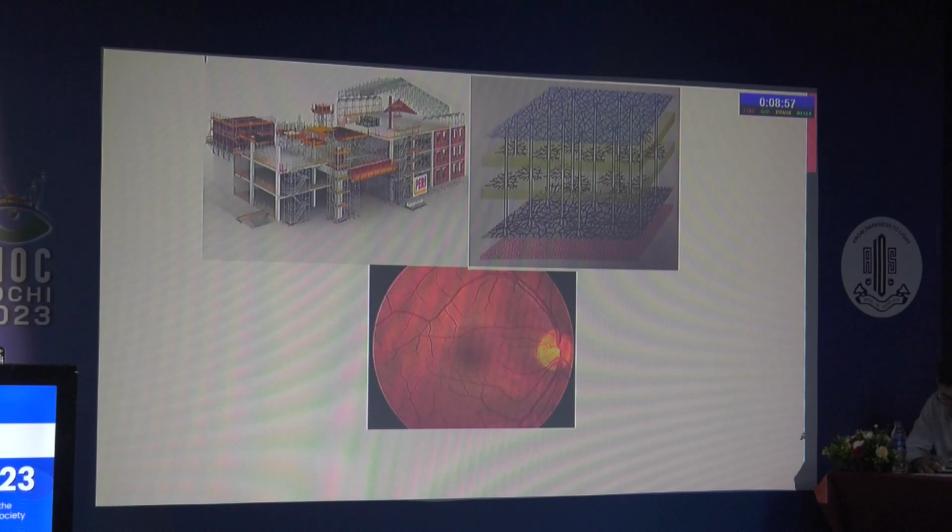I'll just give you a basic guideline on how to interpret your OCT findings. You should visualize the retina like a building coming up. You have beams, you have pillars. All the horizontal structures are like beams, and the columns are the Muller cells. As we all know, they guide the pathologies in the retina to appear differently: a flame-shaped hemorrhage in the neural retina, whereas the deeper retina will give dot and blot hemorrhages. So when you are interpreting OCT, you must remember that the retinal structure is like a building coming up.